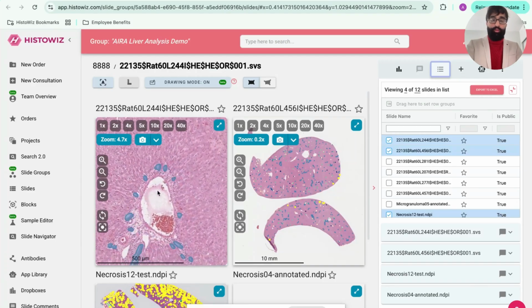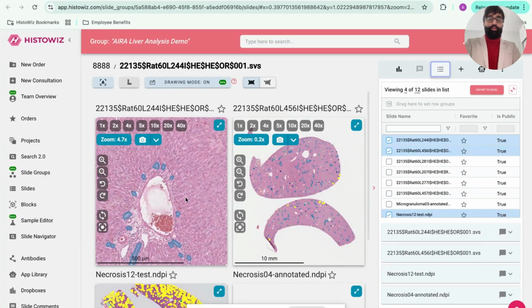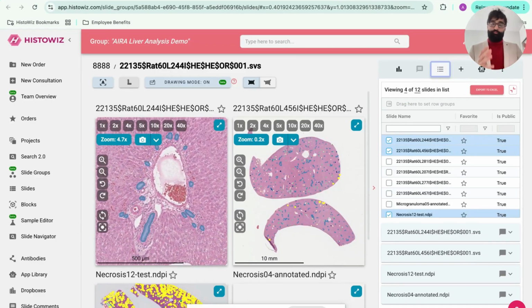Okay, good. So you can look at a specific region of interest and try to compare what's happening across these images. Again, the experience of loading these images side by side and loading the AI result is very quick. Now, of course, to run the AI app, it will take a couple minutes.